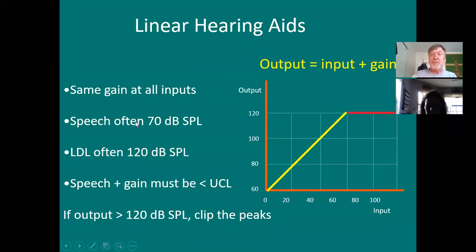A lot of people, I always ask a true-false question every midterm and final exam in this course. So you can bank on this one, okay? Linear hearing aids give the same gain at all frequencies, true or false? And the answer roundly is false, okay? You won't believe though, every year there's always a few people that write down true. Anyway, linear hearing aids, okay?